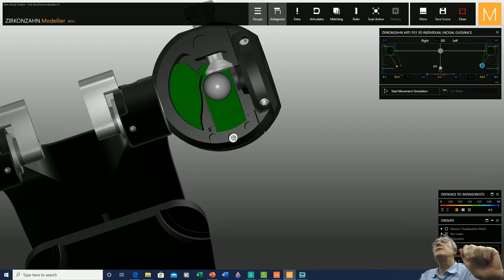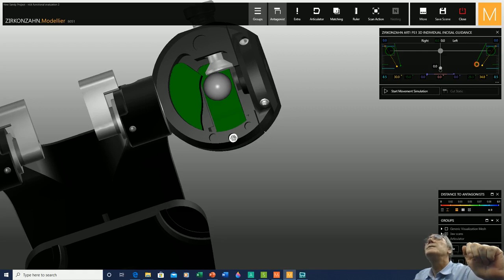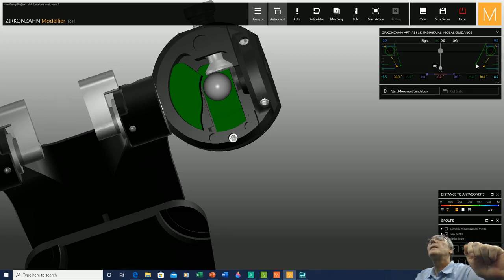I'll decrease the Bennett slightly to access the eminence, and by scrolling I can bring it down more easily than by dragging. I bring the eminence to 30 degrees, and then set the Bennett at 15 degrees — scrolling the little sphere down to 15 degrees. These are just the average values we are going to utilize to perform the first part of the evaluation.